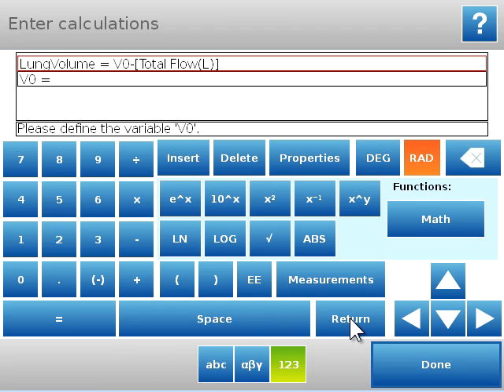Now when I click return it's going to ask me to define V0. This is what's called the functional residual capacity, and for many individuals this will be right around 2.5 liters.